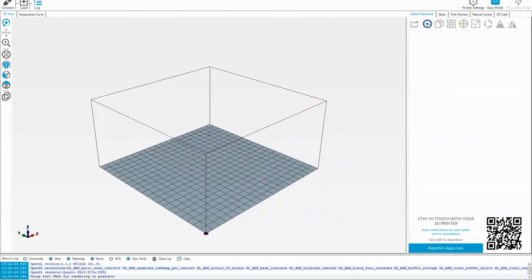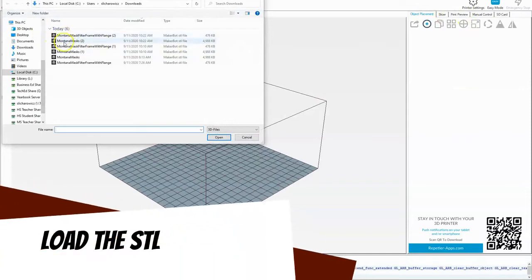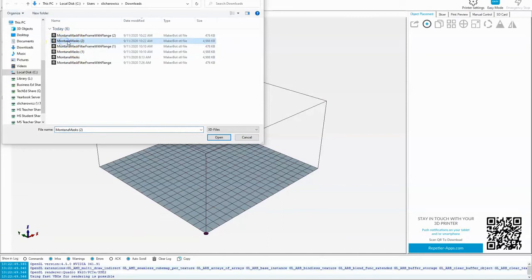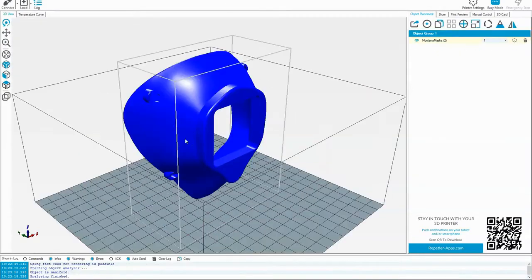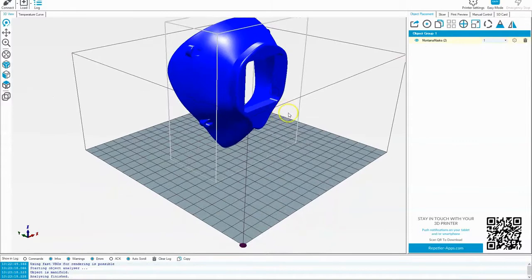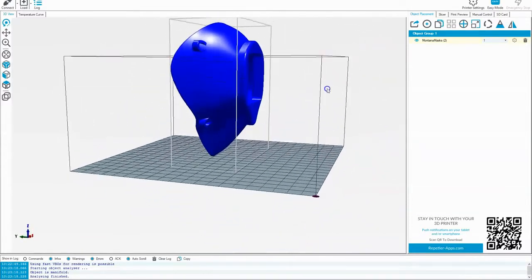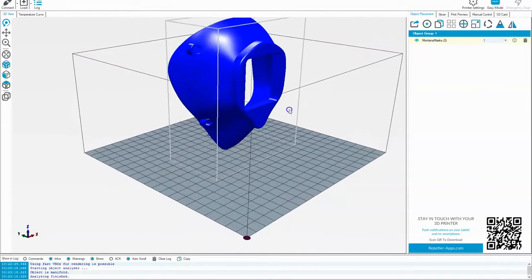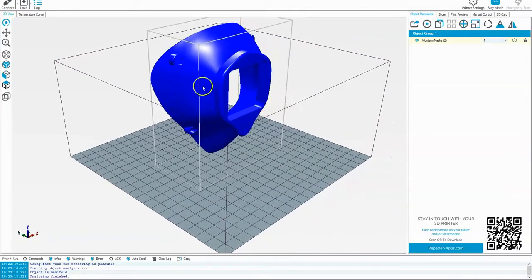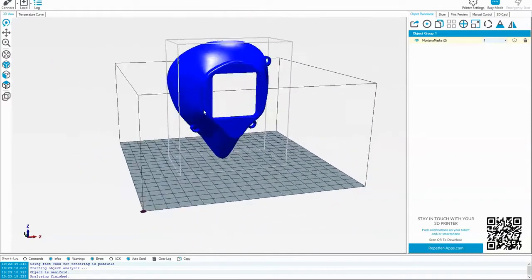So I'll go to object placement, and I'm going to find the Montana mask right here. I've downloaded it a few times, but I'll grab the latest download and hit open. Now I'm going to do the mask and the filter frame separately so that I don't have any concerns about a failure on the mask. The mask does take a few hours to print. So I'm going to start setting up the process here.